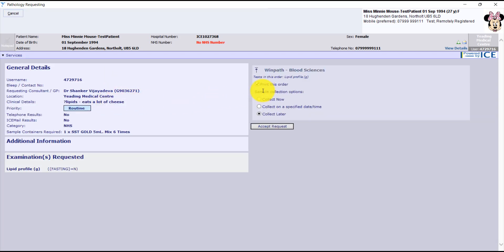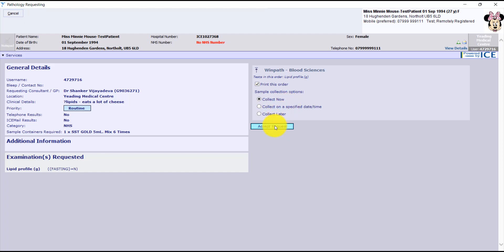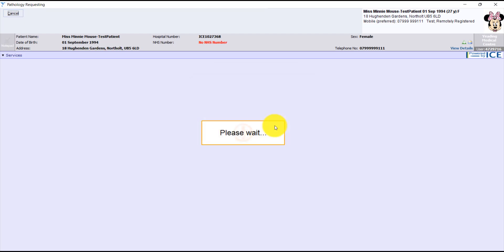And then on the right hand side, we either say if we think it's going to be a bit later, we collect later. Or if we think we're going to take the sample right now, we can click Collect Now. That will make sure it puts the correct date and time that we take the sample if we say Collect Now, because it uses the current date and time.